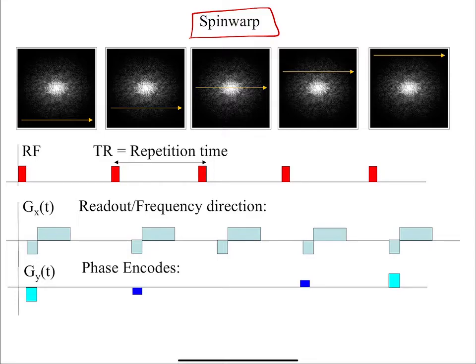You actually have to think about the fundamentals. That's just a warning because typically some people will try to take the spin warp stuff and apply it to EPI. It's not quite one-to-one. You have to think about it a little bit. Hopefully that'll save some people some time.